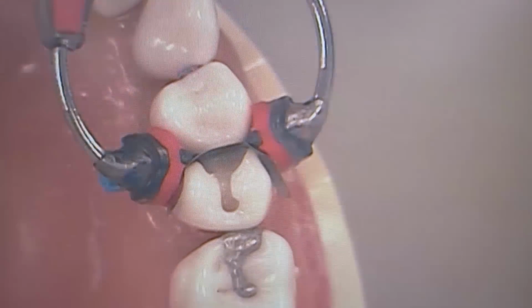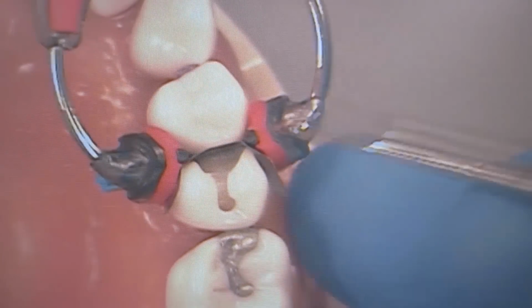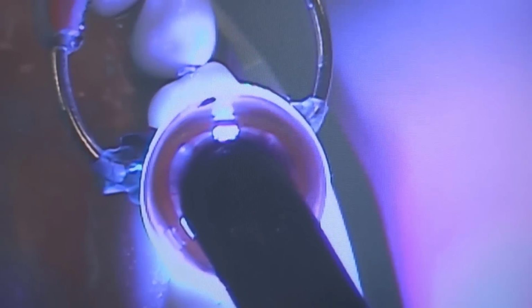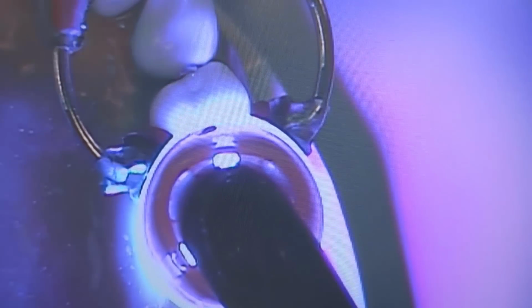Do you have a mirror so I can check the corners? Now that the top of the first layer has been smoothed, Dr. Chui is going to check out the corners of it. First curing of the first layer. Still looking good.